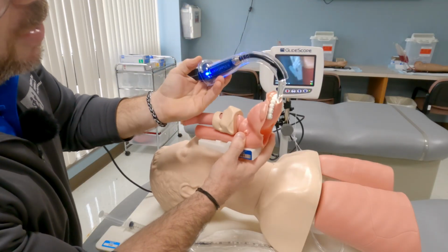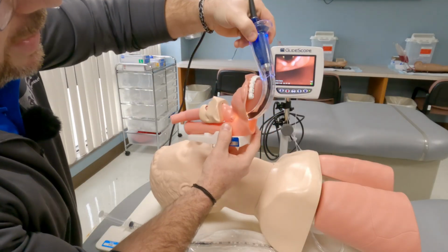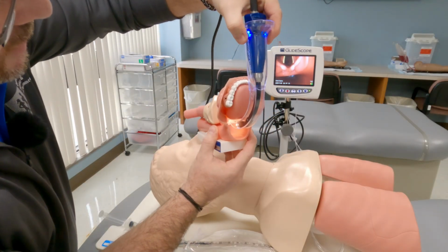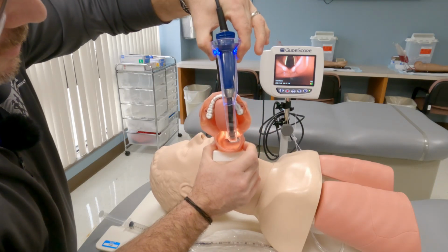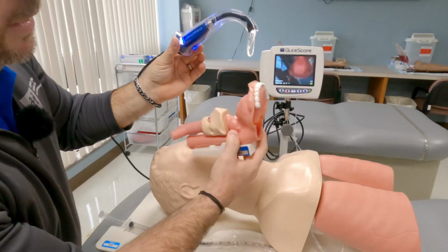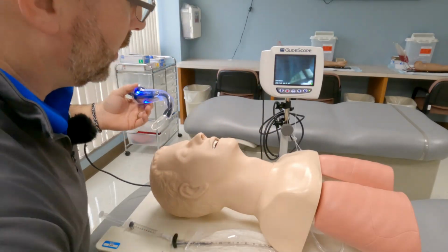So you're just thinking about riding right along the tongue, going down and lifting, and being able to visualize. Now you can see over there on the monitor, that's beautiful, right? That is wonderful. If it only looked that good. So that's exactly what I'm going to be doing with this mannequin.